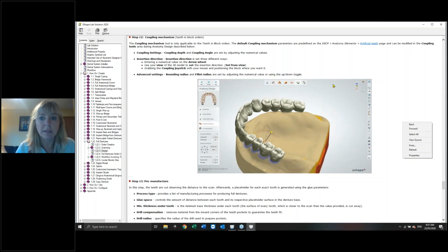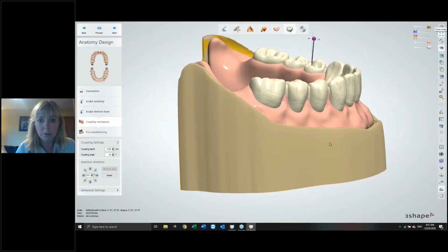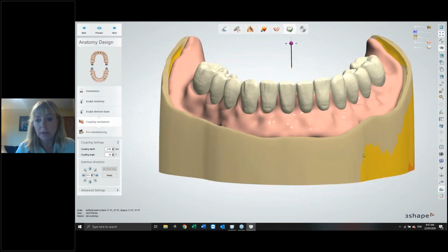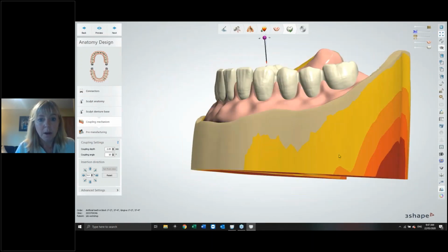When you're starting, really do use this. And it will also give you your fast keys, your workflows, your order forms, anything like that. It's absolutely great when you're starting. Always look into that manual before you ring your helpline.